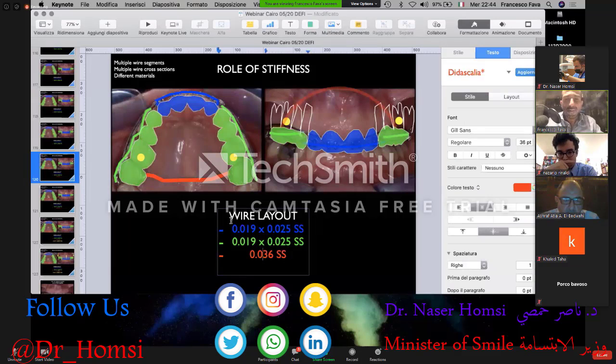For the transpalatal bar, it's 0.9 millimeters. And it's very stiff and allows us to create good anchorage because it's very stiff.